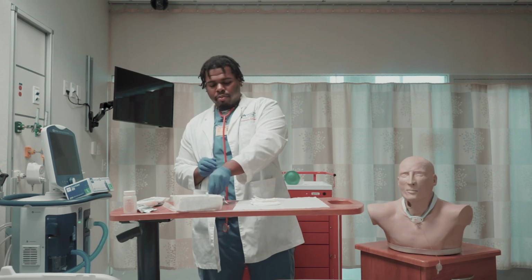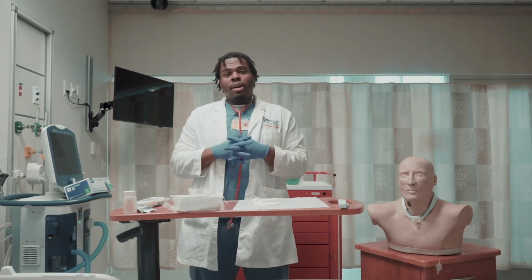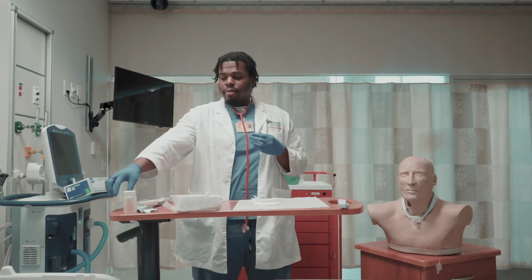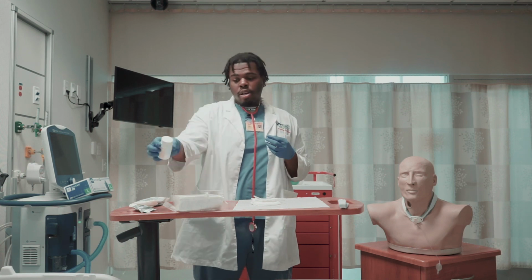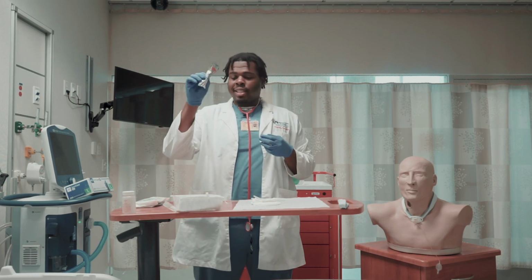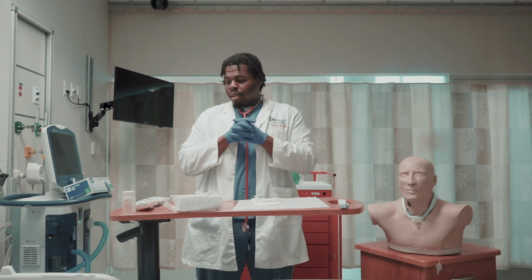I'm going to pour my sterile water and my hydrogen peroxide into the tracheostomy care kit tray. You're going to dump the water into all three trays, and the hydrogen peroxide into one tray, preferably the biggest tray.